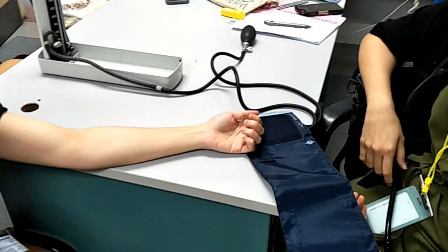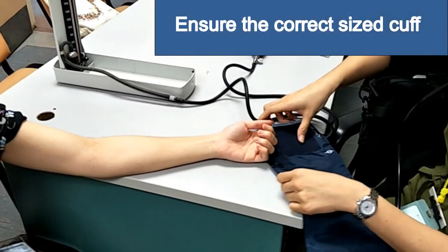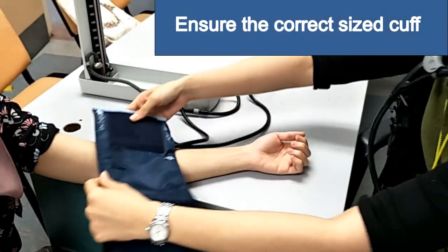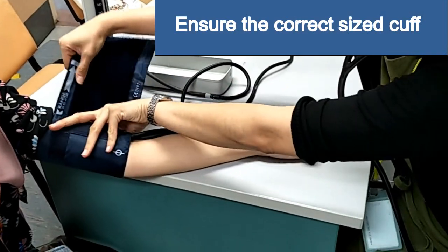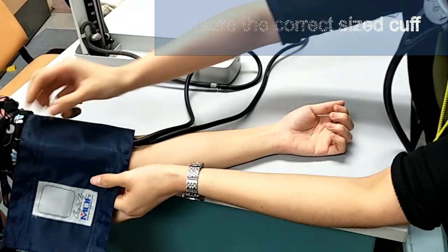To begin blood pressure measurement, make sure the patient is seated opposite to you, with his or her arm at the chest level. Use a properly sized cuff. The cuff should cover at least two-thirds of the upper arm length, and the cuff's bladder at least equal to 80% of the circumference of the upper arm. Wrap the cuff around the upper arm, with the cuff's lower edge one inch above the antecubital fossa.